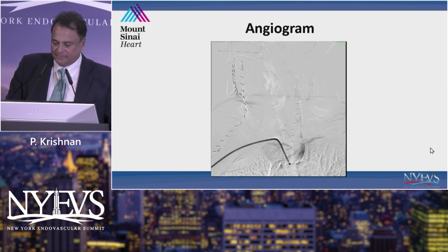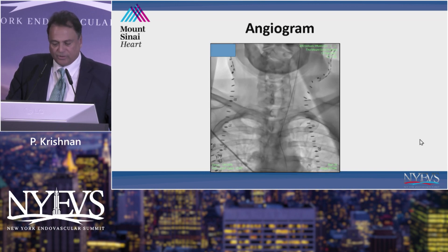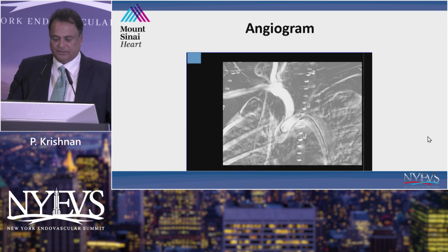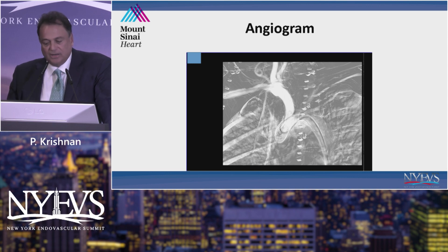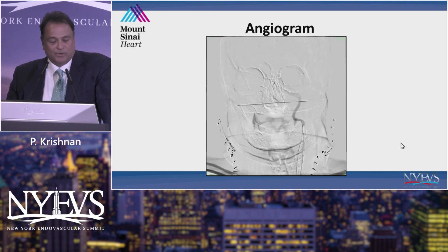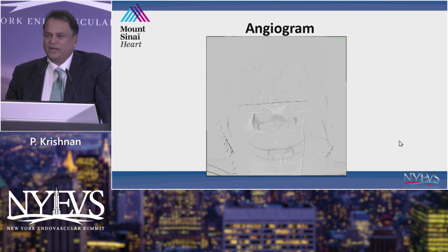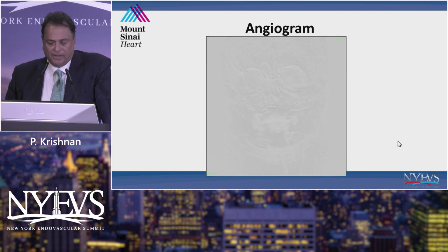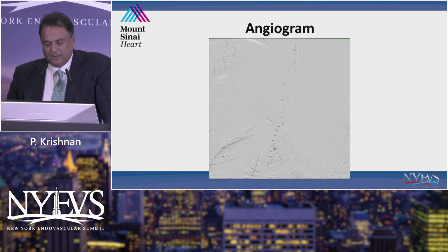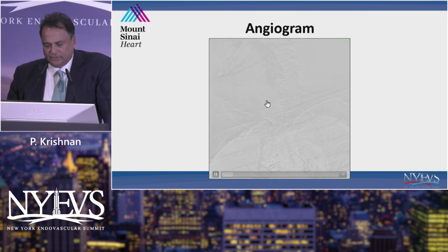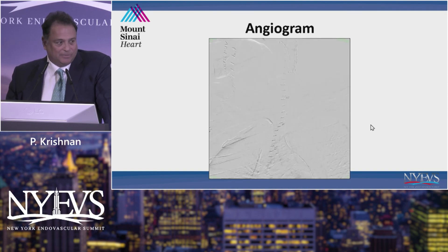We decided to get transfemoral access. With a VTEC catheter, we were able to slowly get an 018 wire up. We checked our position in the internal carotid siphon and found that we were still intraluminal. We said let's go ahead and stent. As we were stenting, you can see there was still no flow; we had our sheath up, but we wanted to make sure we covered the ostium of the left internal carotid artery.